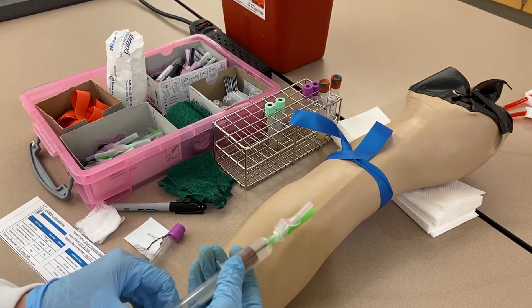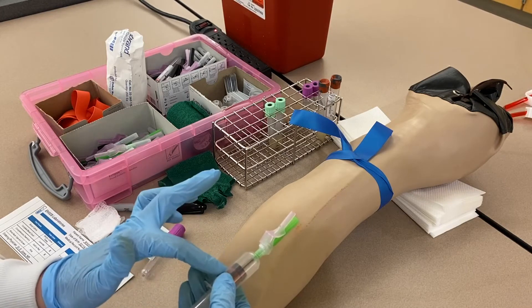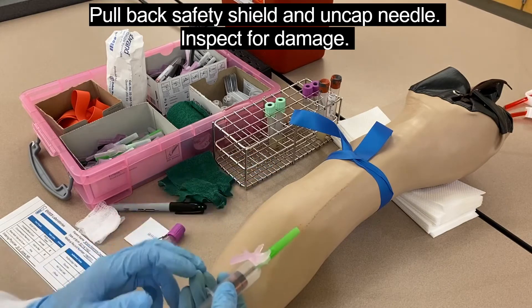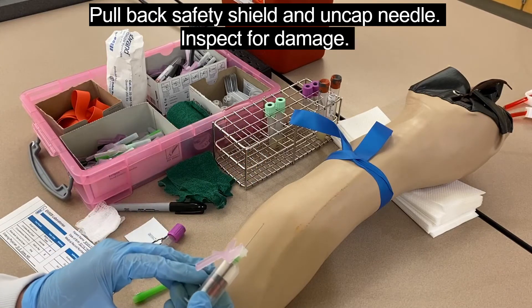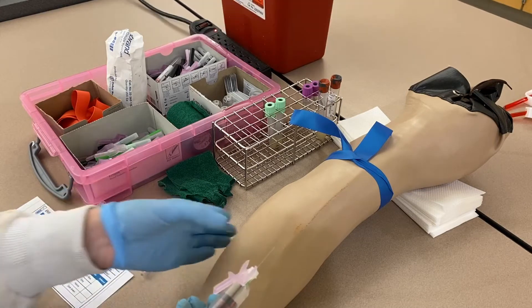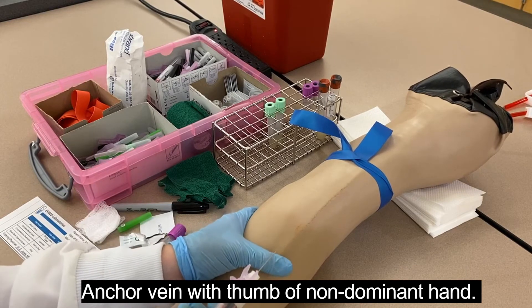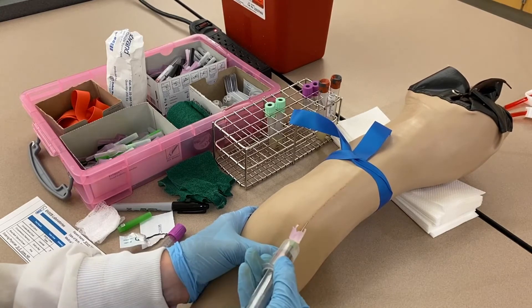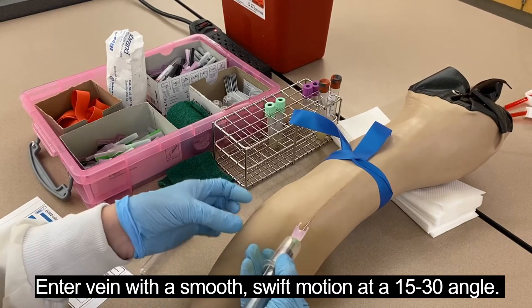Hold the apparatus like a remote control — it's resting in your hand, mostly gripping the tube holder rather than the tube. Pull back the safety feature, take off the cap, and inspect the needle for any burrs or issues that could cause pain. Make sure the bevel is up. Anchor the vein with the thumb of your non-dominant hand a few inches below the draw site, pressing down and pulling taut. Enter at a 15 to 30 degree angle in a firm, swift motion — the slower you go, the more painful it is.